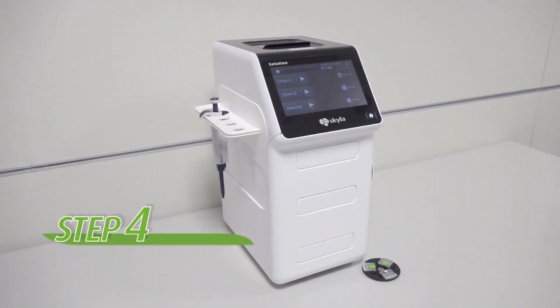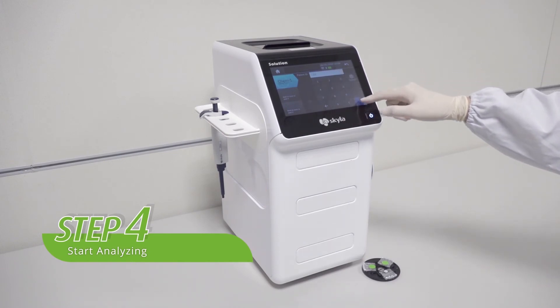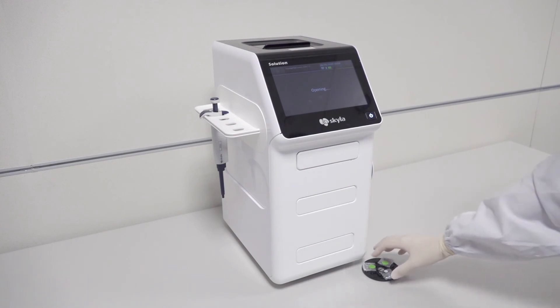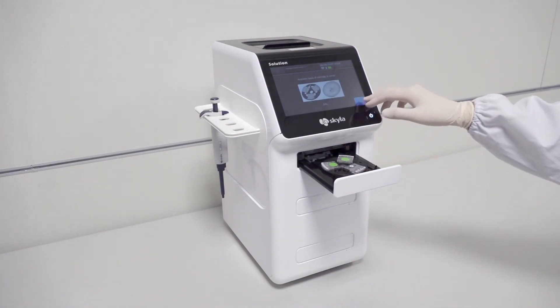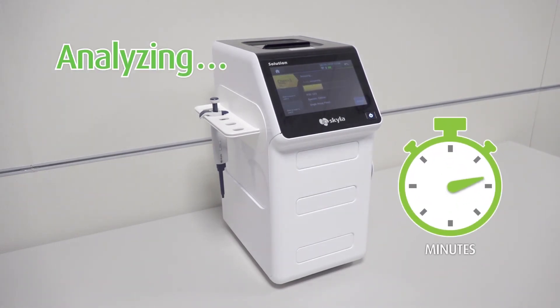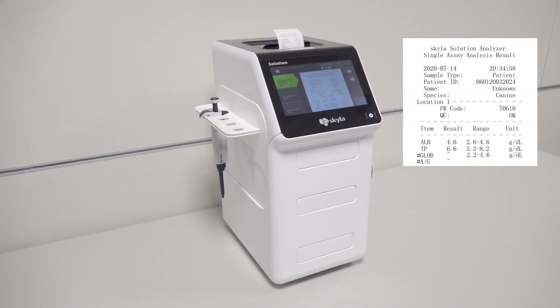Step four: press the Chem-1 icon on the touch screen and input the patient's information. Next, press the OPEN TRAY icon, then put the carrier assay onto the tray, and press OK to start analyzing. After analyzing, the test results will be displayed on the screen and printed automatically.